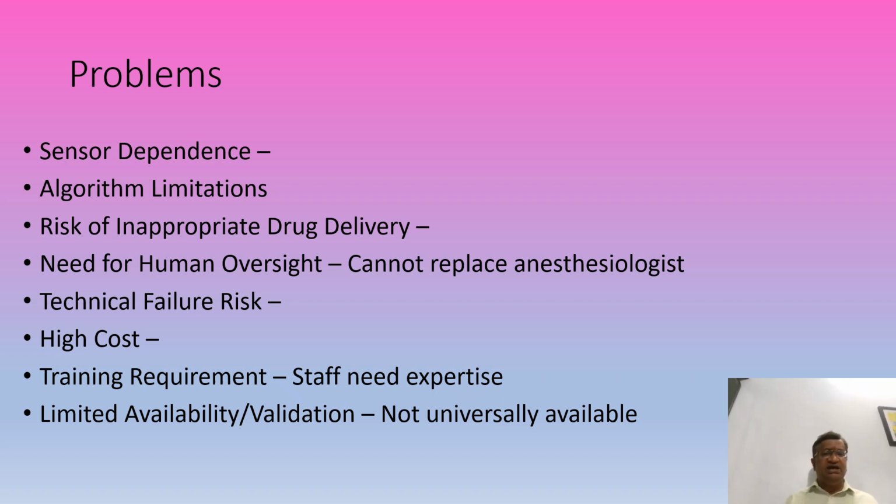High cost. Training requirement, the staff need expertise on how to use it because it's a new equipment. It is costly. So it is not universally validated. Sometimes the validation in Europe may not work for India.